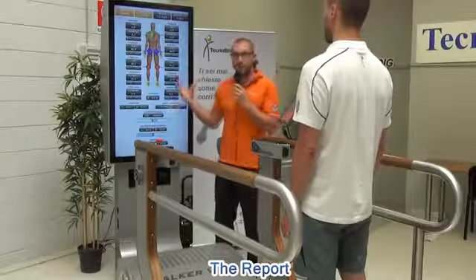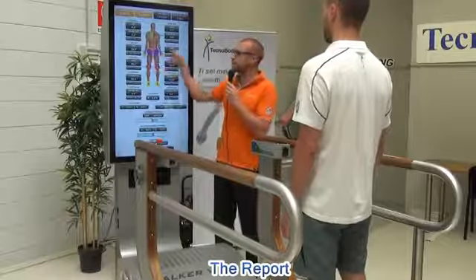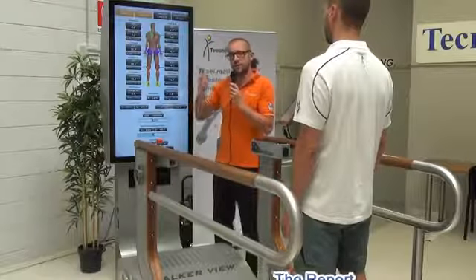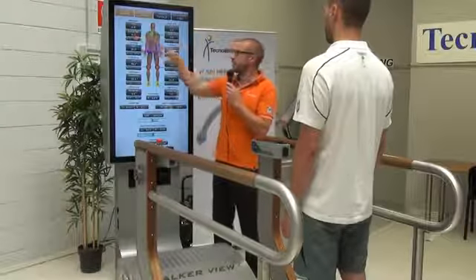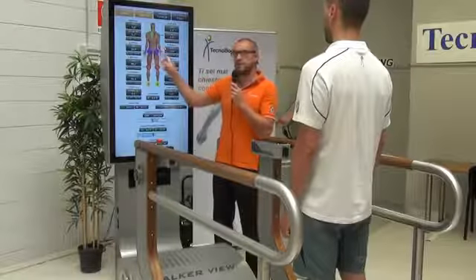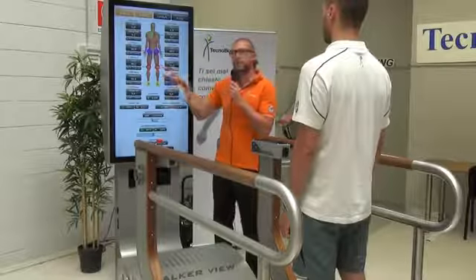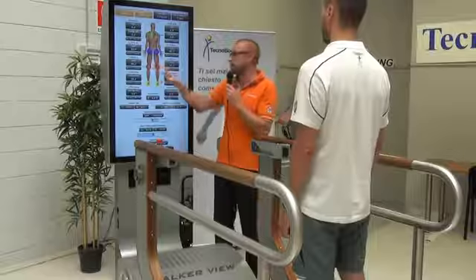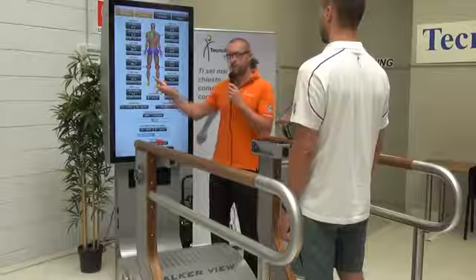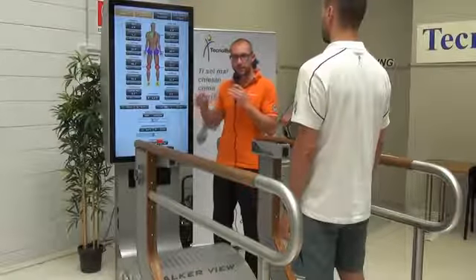Which kind of data does this report provide? Well, through the camera we get a lot of information about the upper part of the body, so about the trunk, both in terms of flexion, extension, and medio-lateral movements, so on the sagittal plane and on the frontal plane, and then we get the comparison between the movement about the flexion extension, the comparison of the hip, left compared to the right, and about the knee movement, always the comparison between left and right. With the new sensors applied on the feet, we can detect information about the movement of the feet in terms of flexion extension and pronation-supination.